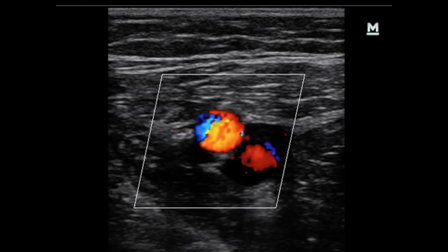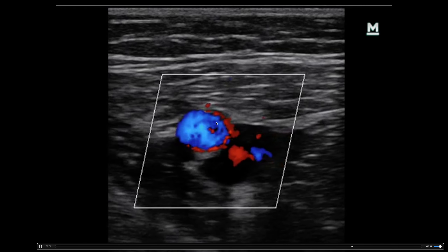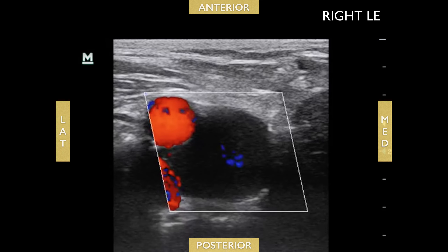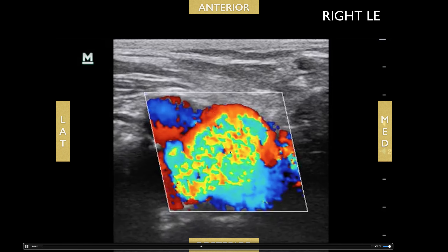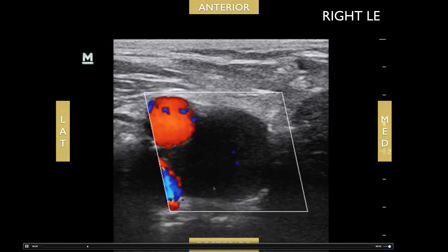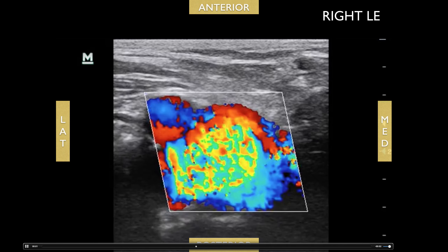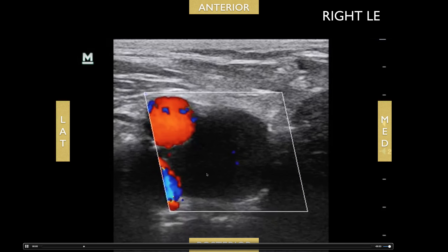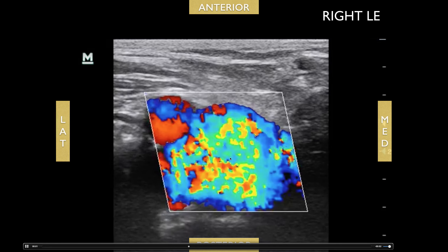For color doppler, you put the color doppler on the vein and artery — you can see the artery here and the vein more medially. Augmentation is done by squeezing the calf to produce blood flow back toward the heart, which causes flow detectable in the vein with color. This is kind of like a Homans sign but using ultrasound. One complication is that if the patient has a large clot, you can dislodge it, so augmentation is not generally recommended for that reason.